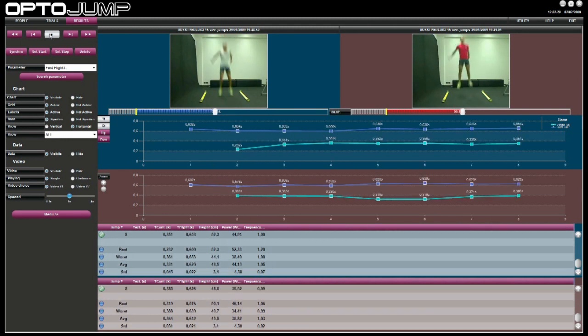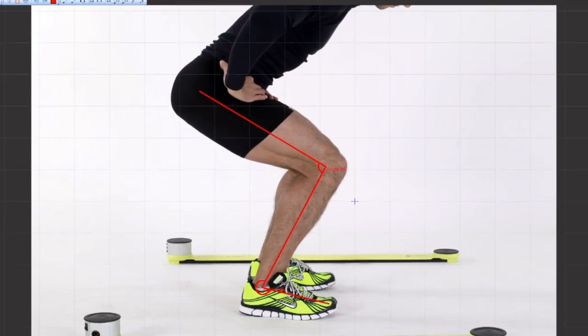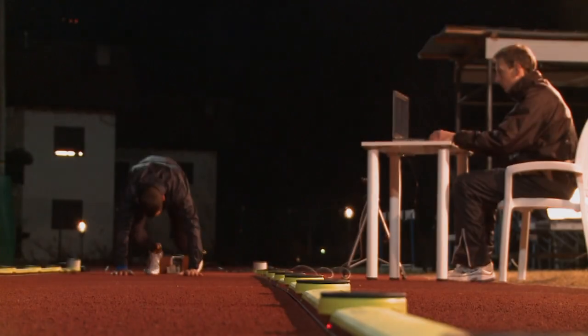It is possible to compare two or more tests. Other video analysis utilities are also available, such as frame-by-frame viewing and graphic tools such as lines, arcs, circles, and goniometers for drawing on freeze-frame images.